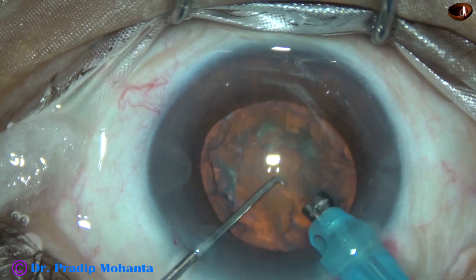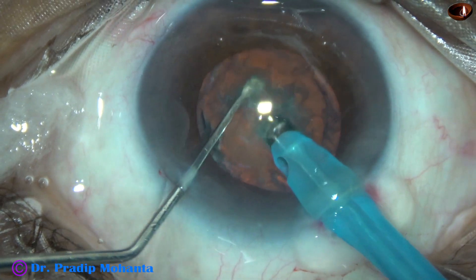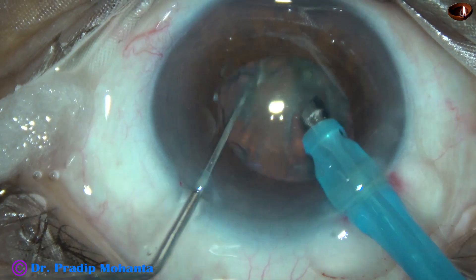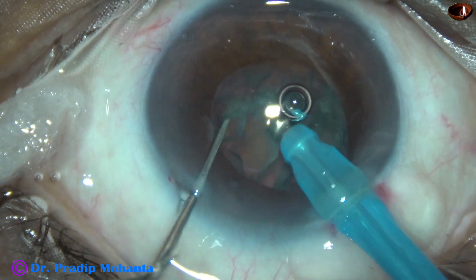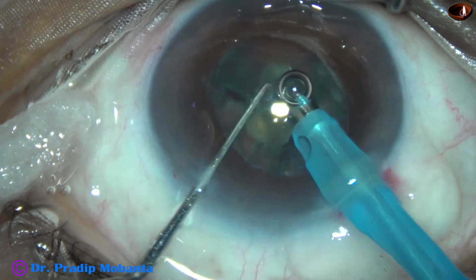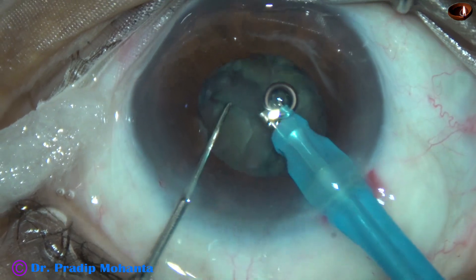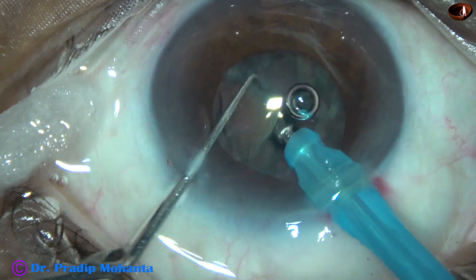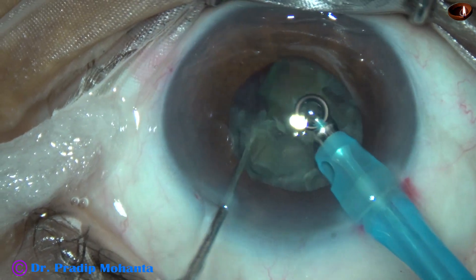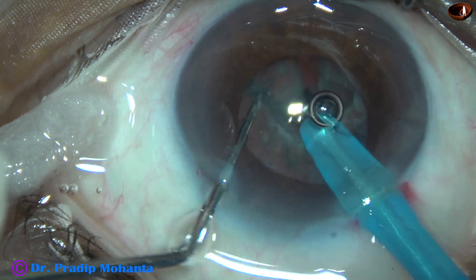Now is the time to chop the nucleus. The tip of the phaco needle is buried into the substance of the nucleus and it goes up to the middle, because the nucleus is not very hard. When the nucleus is of this consistency — about grade 2 plus nuclear sclerosis — we should not go beyond the center of the nucleus to hold the lens mass. The nucleus is chopped into several fragments and each fragment is emulsified.